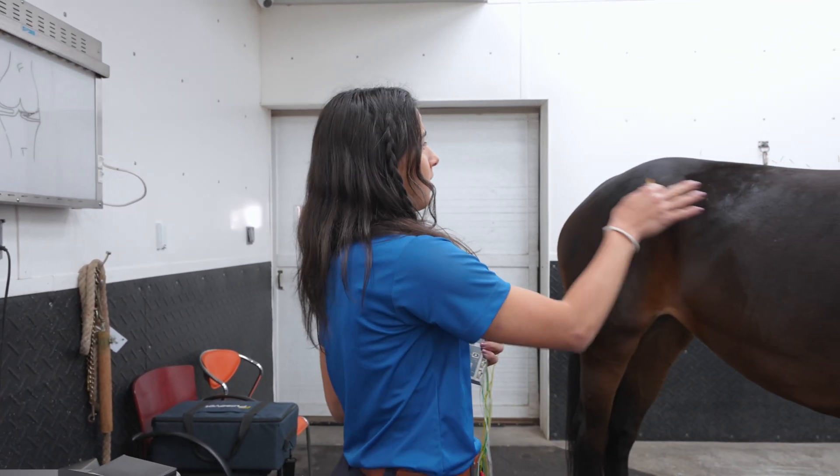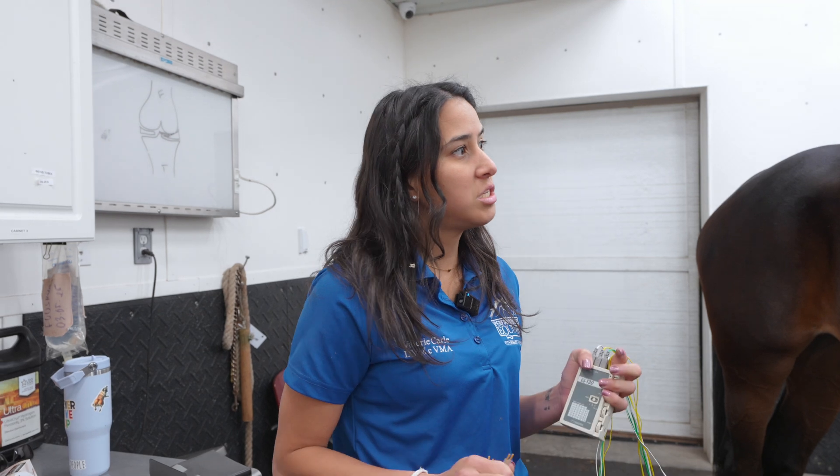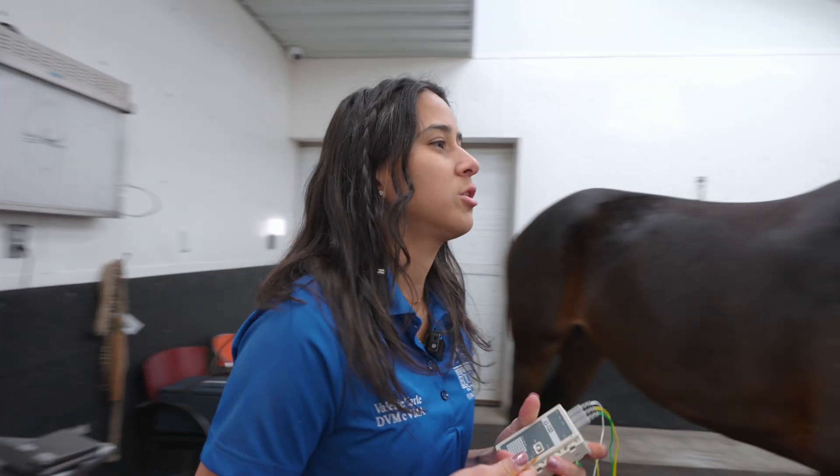She already has a lot of needles placed on one side, and I already placed a little bit of needles on the other side. I'm just going to continue placing needles until she tells me no more needles, and then we'll do the electroacupuncture. Let's go.